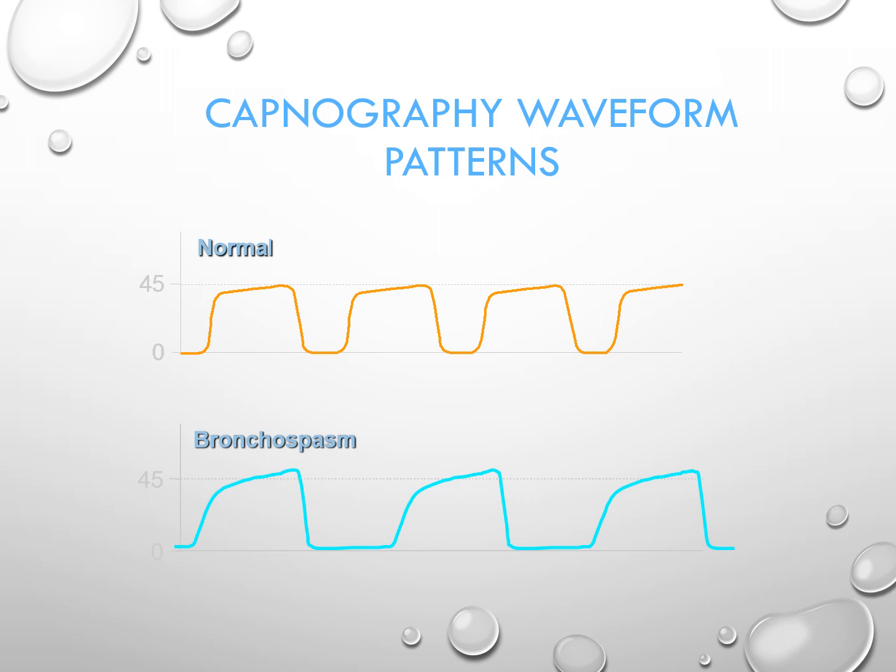But again, not diagnosing the patient based on this. If they are an asthmatic or in status asthmaticus or on a ventilator, etc., and you're seeing this waveform, don't be surprised if you see a waveform that looks like a shark fin.